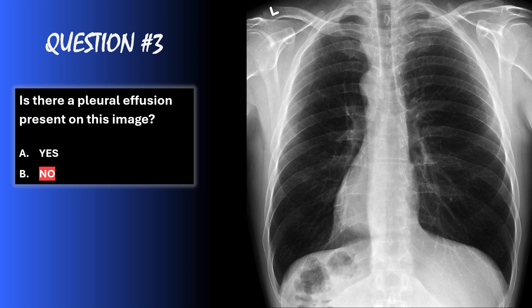No — there is not a pleural effusion here. This is a normal chest x-ray, and you can clearly see the costophrenic angles are sharp and clear of fluid.